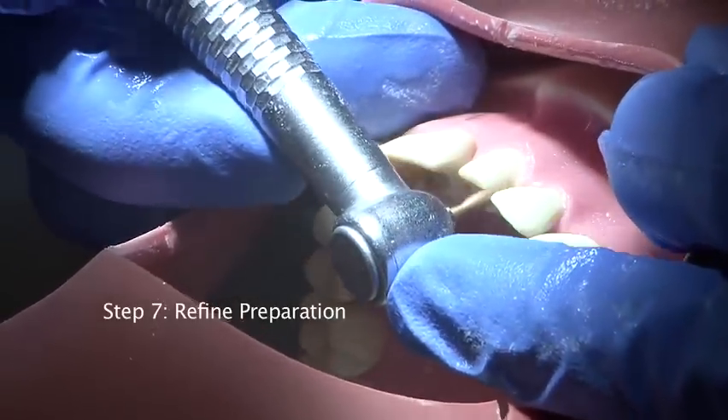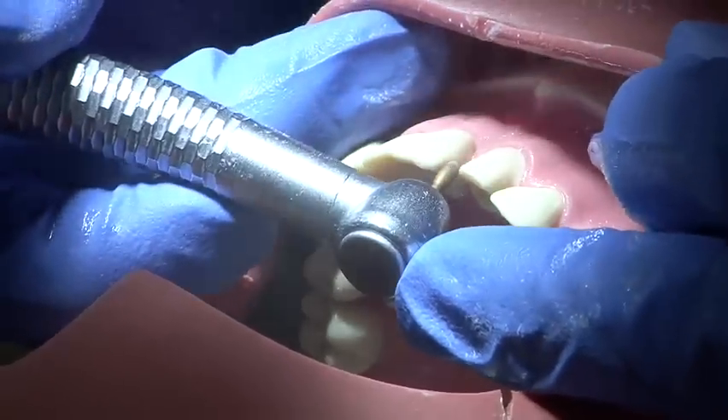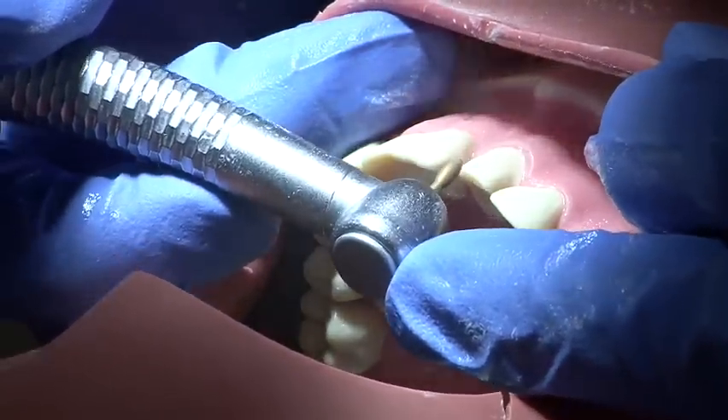Finally, the preparation is inspected and refined using a fine grit burr to ensure that surfaces are smooth and evenly reduced.